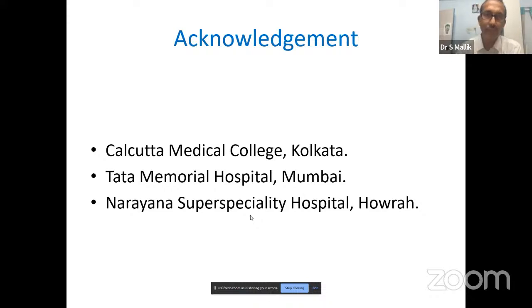If possible, if the patient has a basic CT scan at the time of evaluation, you look at the CT scan, you look at the location of the retropharyngeal node, and based on that you decide on your posterior border of phase 2. If not possible, then please don't consider treating gross retropharyngeal node with a 2D technique, because in phase 2 you may miss the retropharyngeal lymph node if it is going posteriorly or going parapharynx, because sometimes you cannot cover that with electron boost adequately. So you have to be very careful.